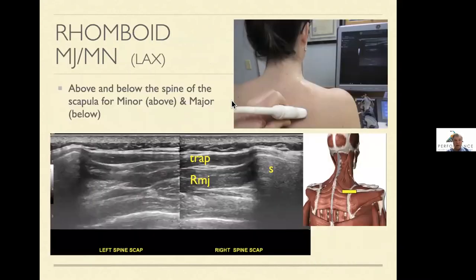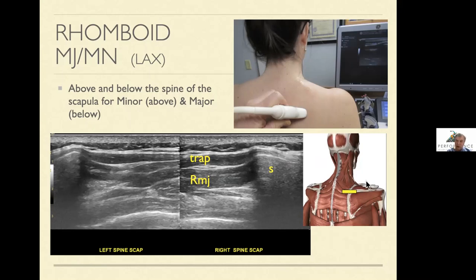Once I've completed that, I look at rhomboid major up and down the entire medial border of the scapula, above and below the spine of the scapula. Above that bony margin you're in the minor; below, it's major. If you're unsure where the spine of the scapula is, run up and down the medial border until you see the solid white line of the bone — the bony margin of the spine of the scapula. Here's trap fibers, rhomboid, rib, and lung. Look for normal smooth echo texture versus the irregularity and volume loss seen with pathology of the rhomboid major.